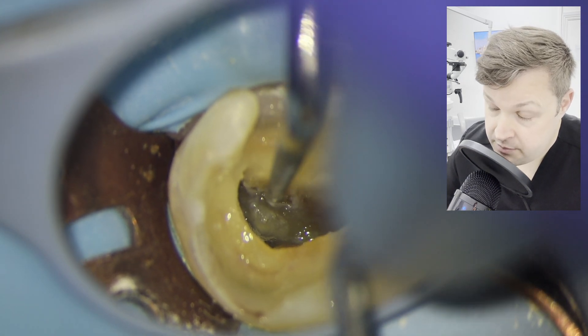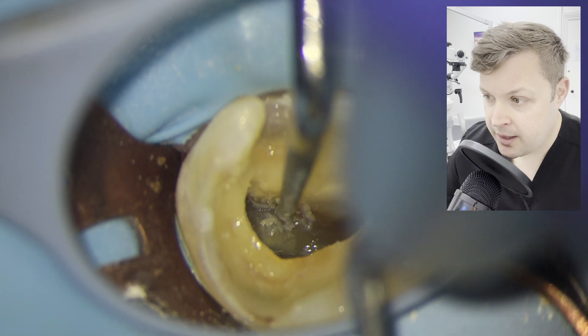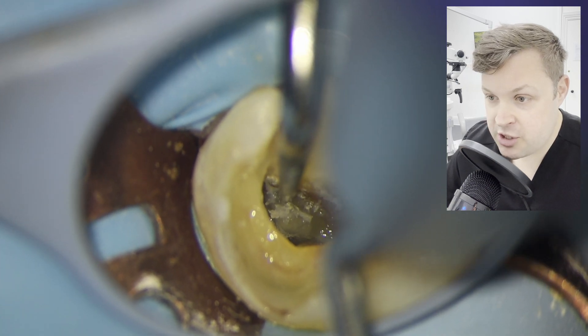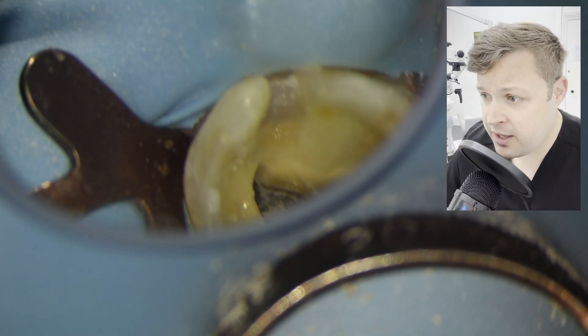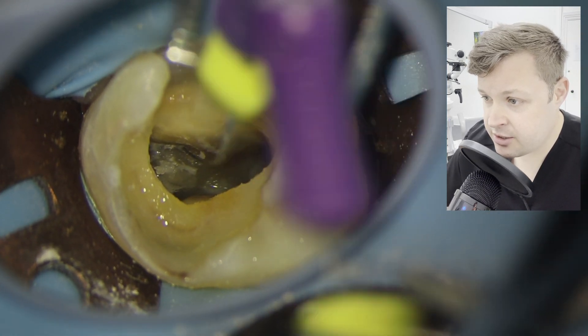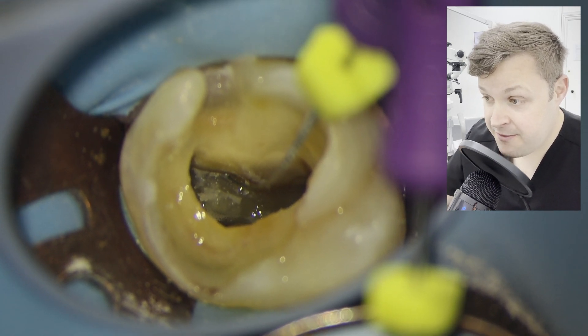The benefit of perforating with these tips is it's usually only a pinprick and very easy to repair — less dramatic than perforating with a fast handpiece. It also gives you a nice clear field of view so you can see the tip as you're removing dentin. I've removed the dentin shelf and I think I can see an orifice. I'm going to use a size 10K file, slightly bent, because it's difficult to get into the plane of attack for the MB2. I'm slowly watch-winding in, and the file sticks up nicely — so I think I'm in some kind of orifice.